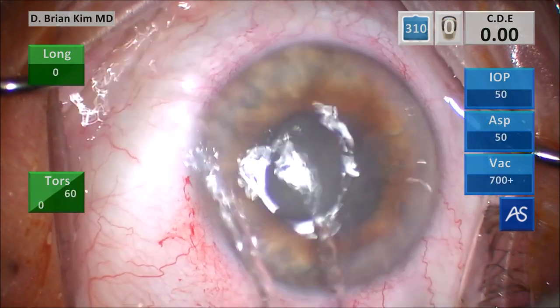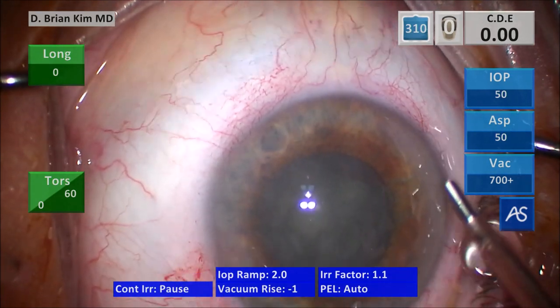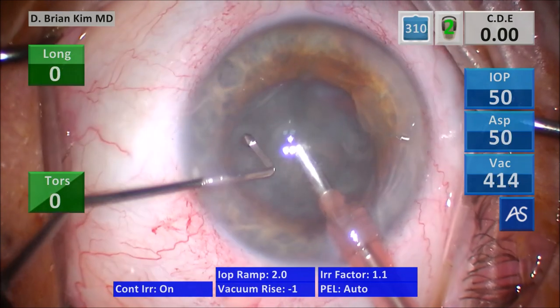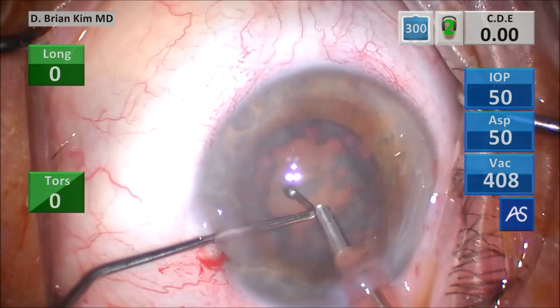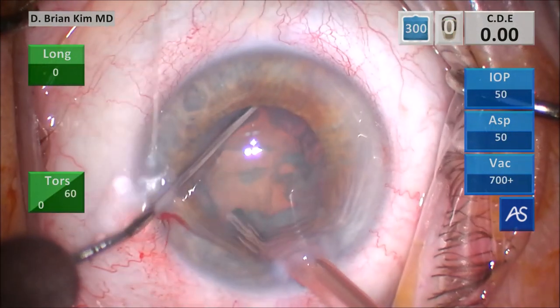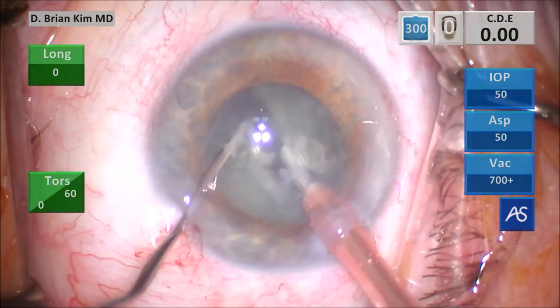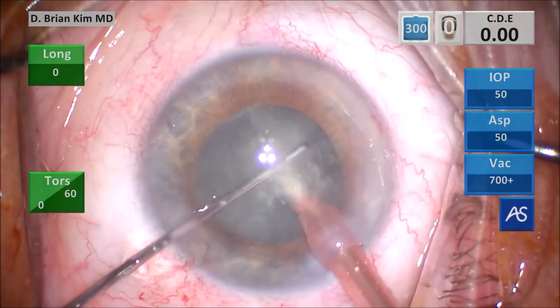I go ahead and irrigate the surface of the cornea, adjusting the sleeve, lifting the incision with the chopper, going in with irrigation off to minimize Descemet's trauma, removing the surface epinuclear material, placing the chopper underneath the rhexis edge contra-incisionally, pointing the phaco tip vertically sub-incisionally, getting it deep, bisecting the lens, bringing the instruments together, crushing the lens with mechanical forces.